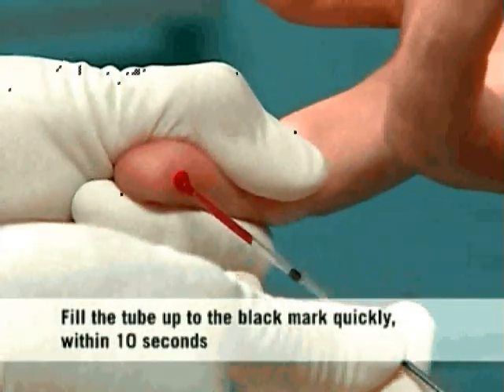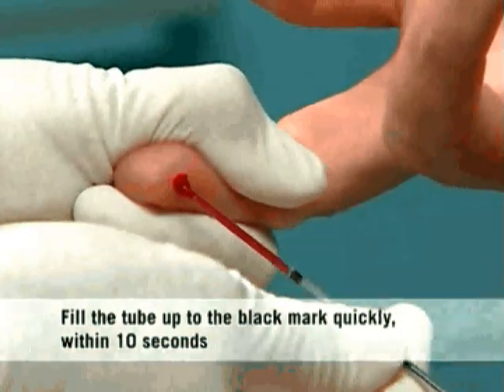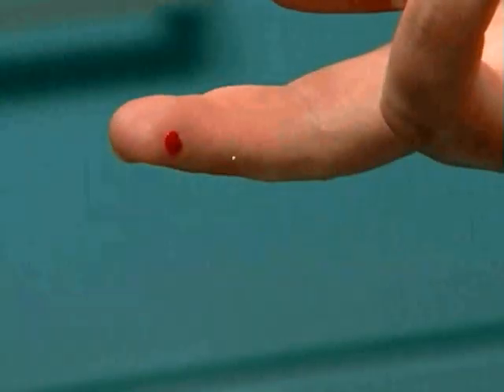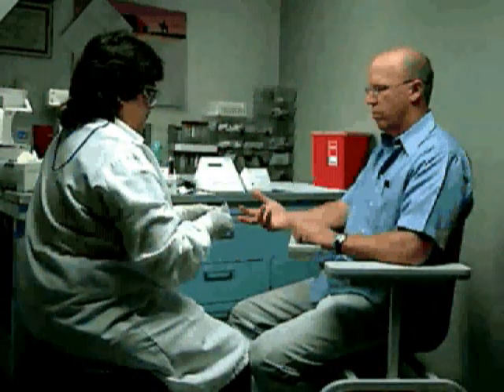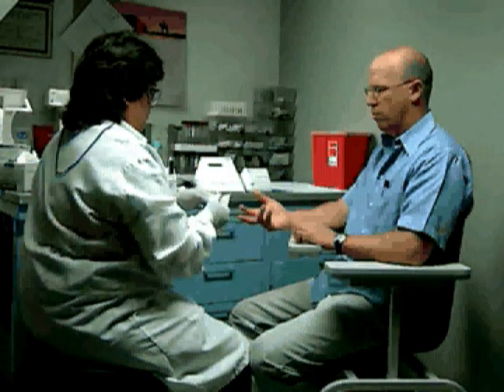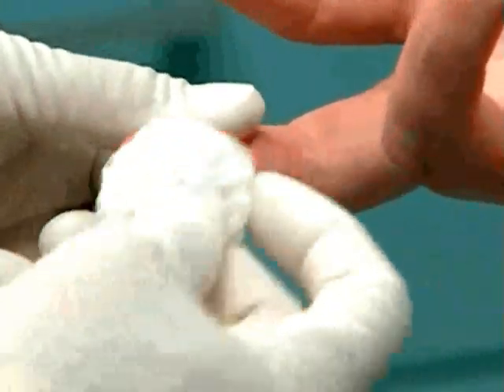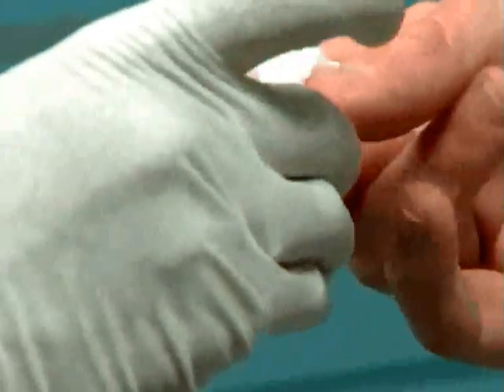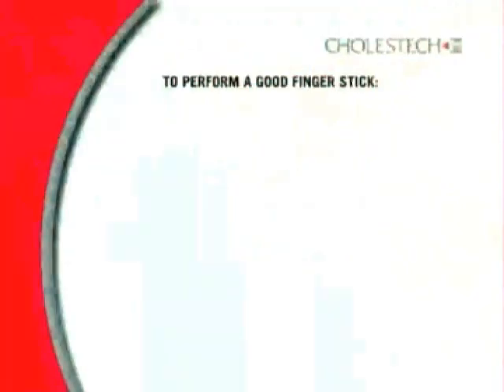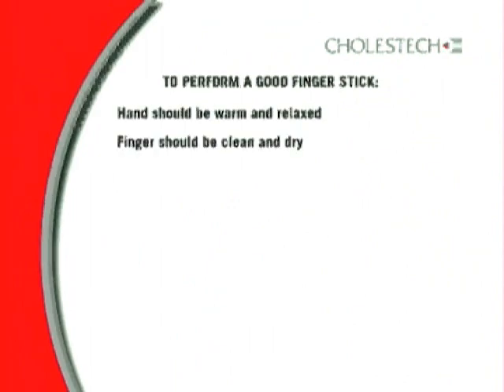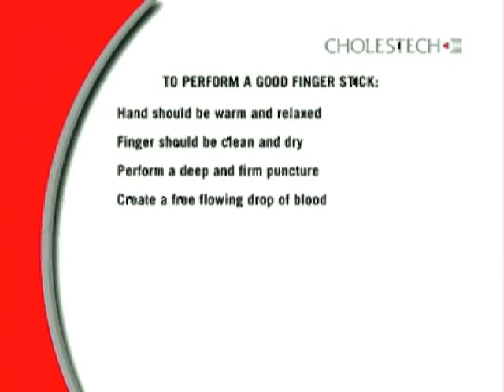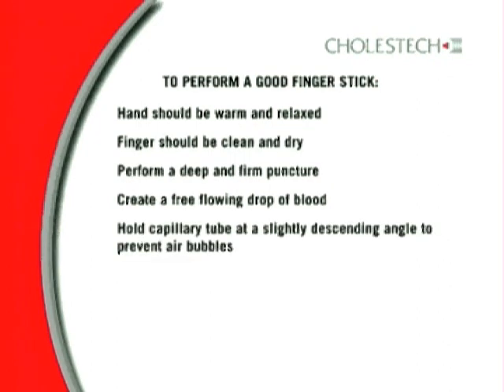Fill the tube up to the black mark quickly within 10 seconds or the blood may clot. If necessary, gently squeeze the entire finger and release to increase blood flow to the puncture site. If there is poor blood flow, reopen the puncture site by wiping firmly with a gauze pad. Keeping the hand below heart level will also increase blood flow. After filling the tube, have the patient press a gauze pad on the puncture site until the bleeding stops. Remember: the hand should be warm and relaxed, the finger clean and dry, perform a deep and firm puncture, create a free-flowing drop of blood, hold the capillary tube at a slightly descending angle to prevent air bubbles, and fill the capillary tube in under 10 seconds.